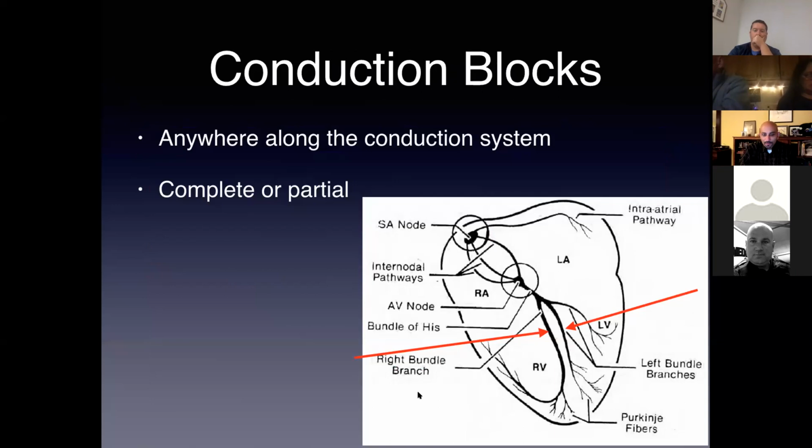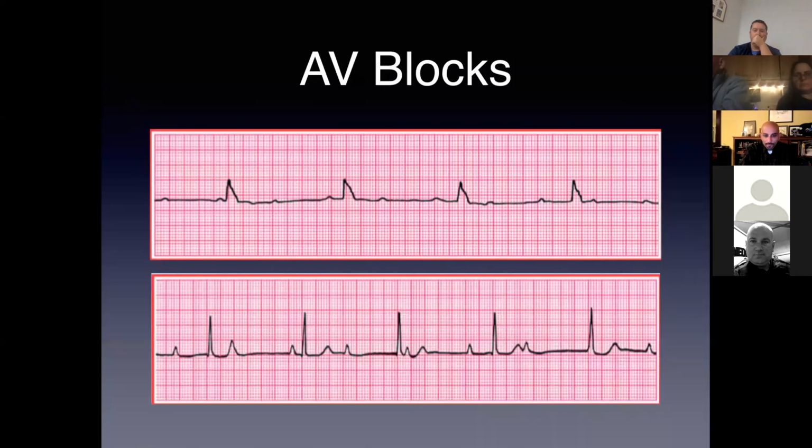So Joe, a third degree block, is it a ventricular rhythm then? Not always, that's my point. Sometimes the junction takes over, or someplace below the junction, and it gets into the conduction system and conducts narrow. So it's not always a wide complex in third degree. You can have third degree with a narrow complex. That's why I put this in there. Got it. It's a good question.